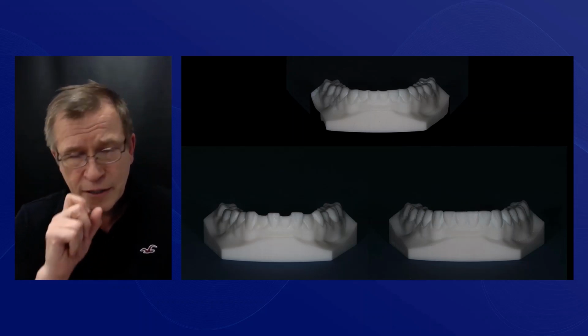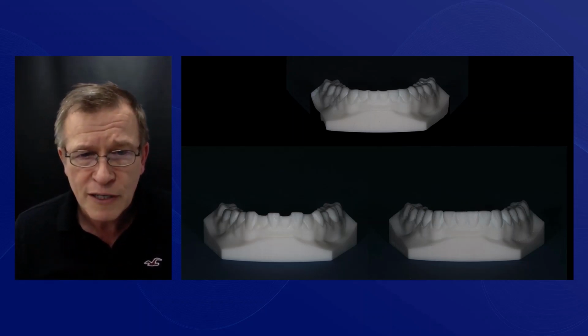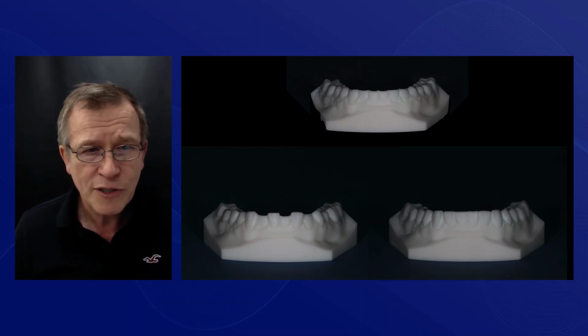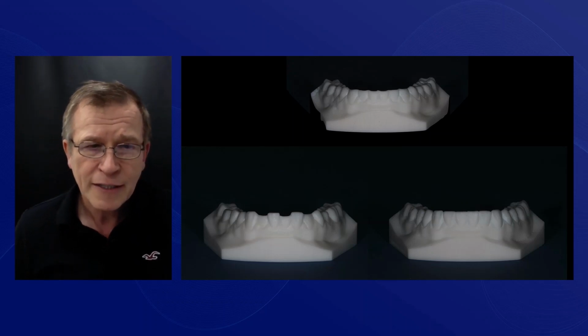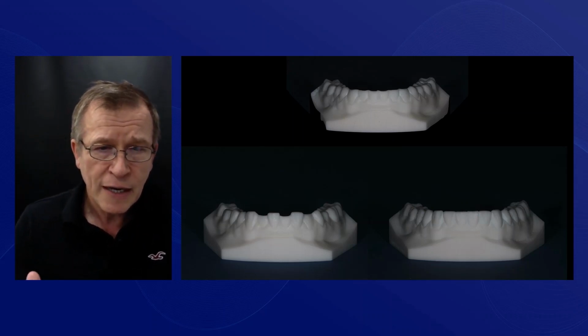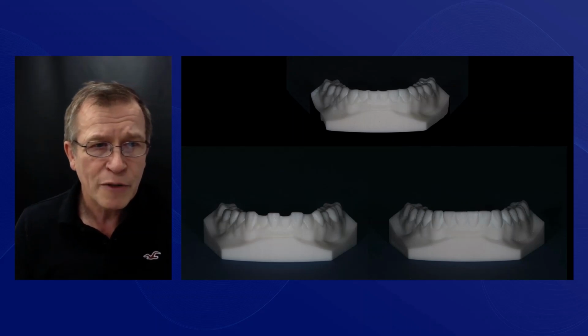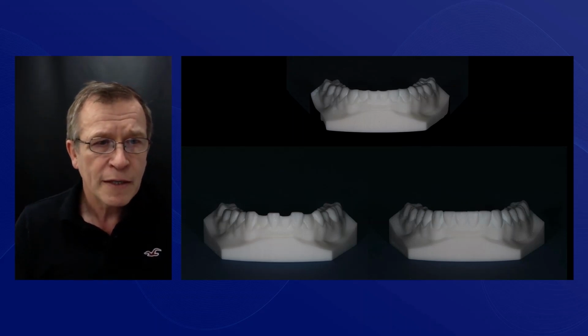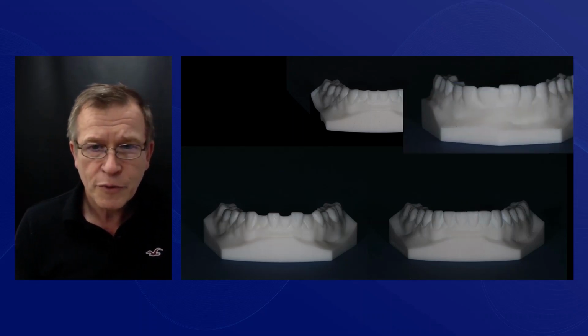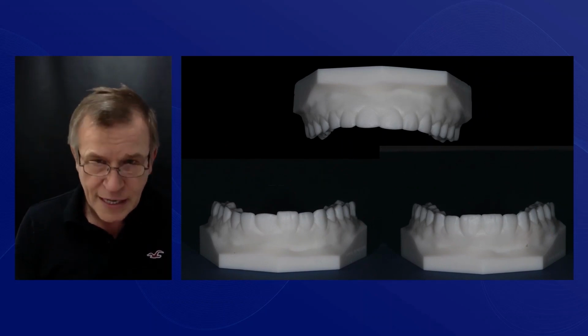And also this is a very useful thing to do if you're doing this sort of case, what's called an every other tooth model. Again, this used to take quite some time to generate. Now we can do it at the press of a button, and Chemek can send me both of these. Every other tooth models allow you to place individualized temporaries really, really quickly and efficiently with good morphology. So this was the lower, this is the upper, exactly the same.